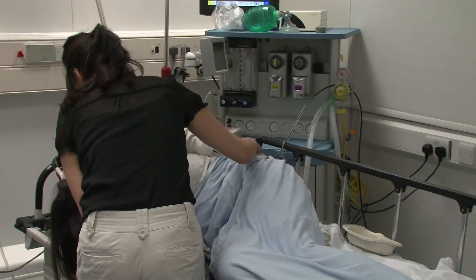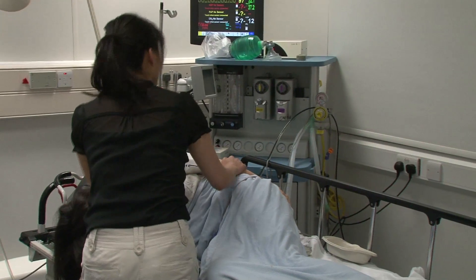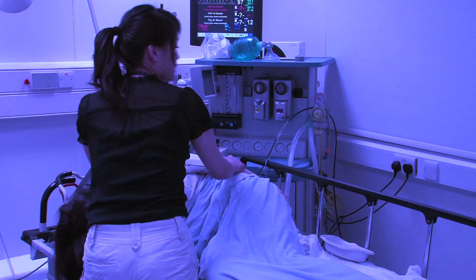Help, can I get some help in here? If the patient is vomiting, you should roll them onto their side to reduce the risk of aspiration.